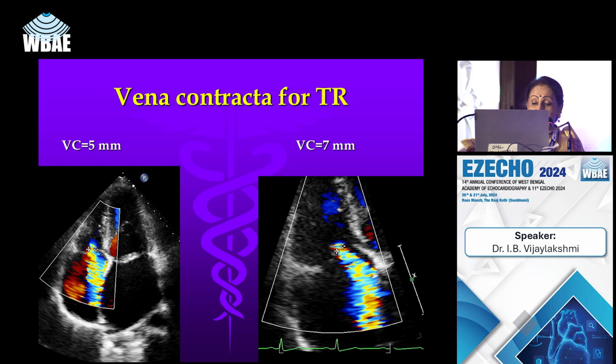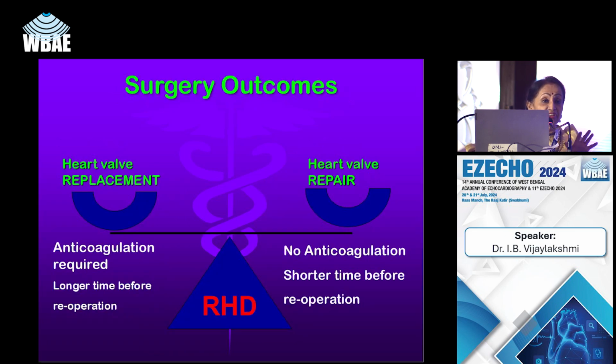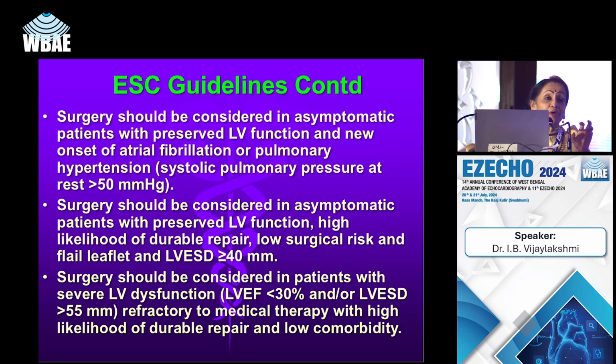So here it is grade 1 to 2, that is mild to moderate AR is mentioned, and mild to moderate AR means balloon dilatation for mitral stenosis is still not an absolute contraindication. Still it can be done, but if the mitral stenosis balloon dilatation is not possible in this patient, then we have to assess the aortic valve also, because the surgeon can do the aortic valve repair also.